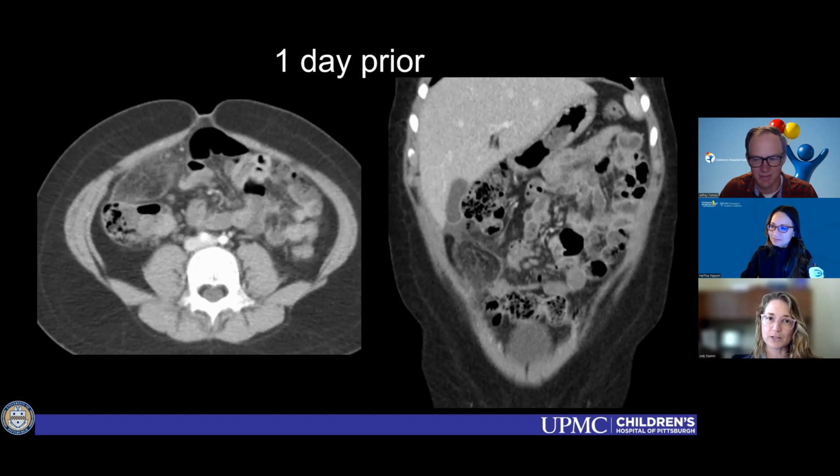Yeah, I think it varies. Overnight, probably unsuccessful because of the overnight workflow. But during the daytime, if I speak directly to surgery or whoever is requesting it, they usually don't push for it, but they will ask us to do an overread. If that's the case, we would have to overread that diagnostic CT, which is fine. So I guess you either scan again on ultrasound and dictate that, or render an overread.